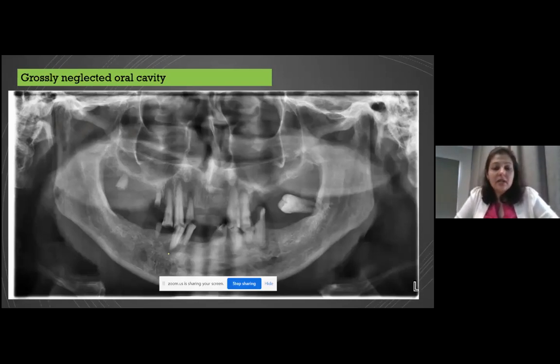Now I have a collection here of about 20 odd cases which are all from our bank in PIDC, and I'm very thankful for that. So I have used all original patient radiographs. Of course, you will not be able to identify them.